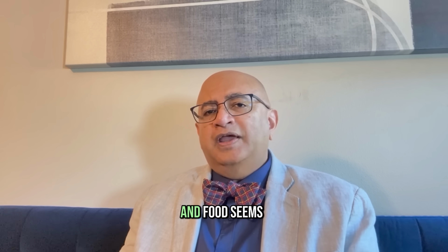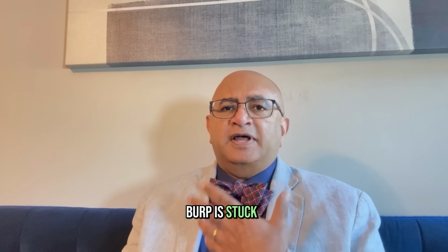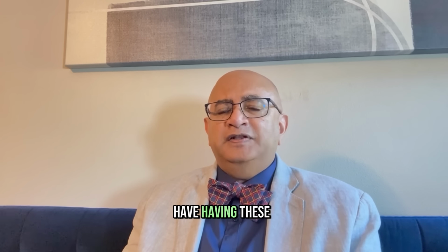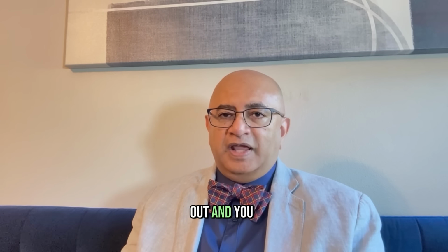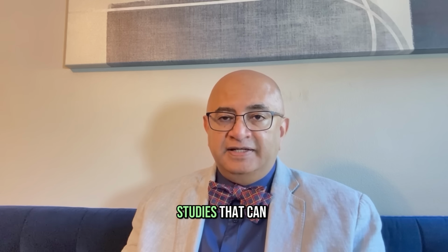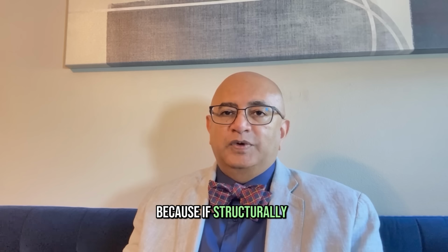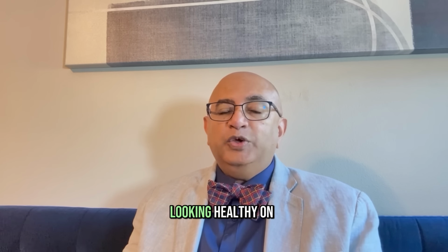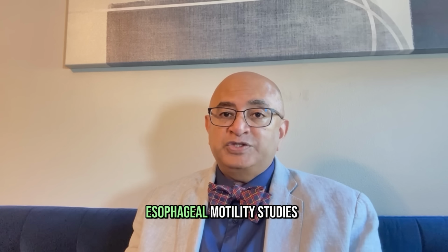I cannot swallow and food seems to get stuck, or I cannot burp because it feels like my burp is stuck. So what are these things? Why am I having this bloating and these symptoms? What you need to find out, and you ask your gastroenterologist, is: is there esophageal manometry or motility studies that can be done for me? That's the question you want to ask. Because if structurally nothing looks wrong, your esophagus is looking healthy on endoscopy and on upper GI barium study, but you have these ongoing symptoms, you may need manometry studies, esophageal motility studies.